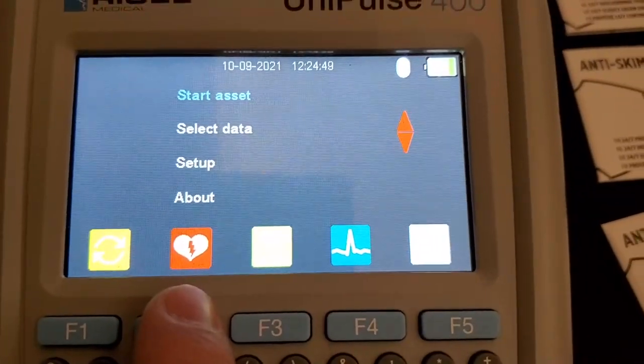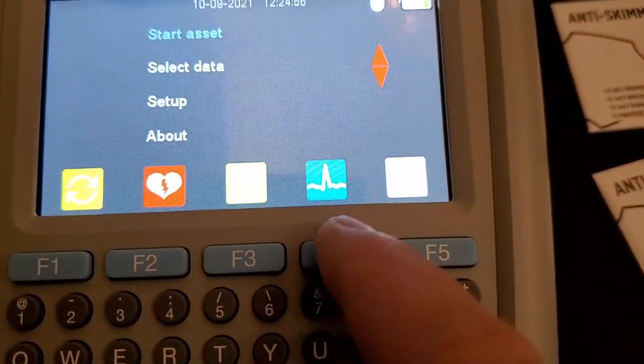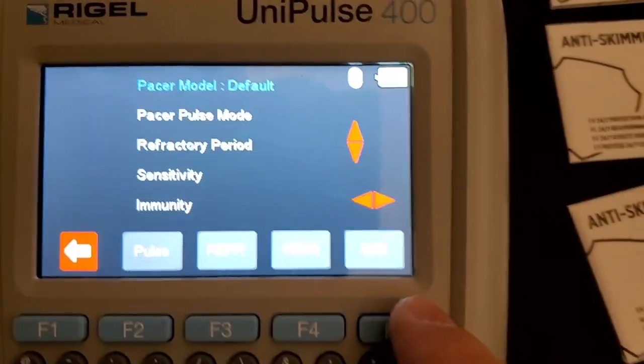So we have regular defib mode, we have AED mode, and then we've got the simulator mode. And I wasn't sure what this one is — let's check it out — okay, pacer. Okay.